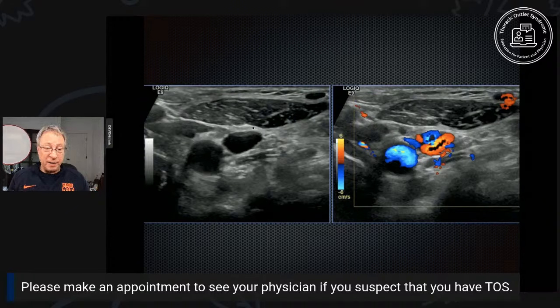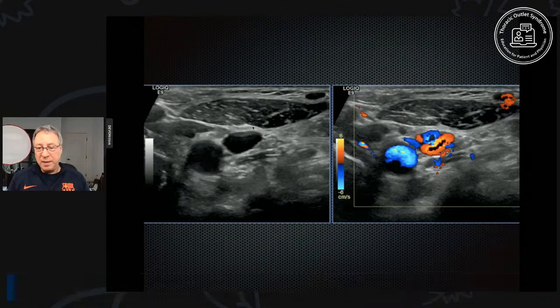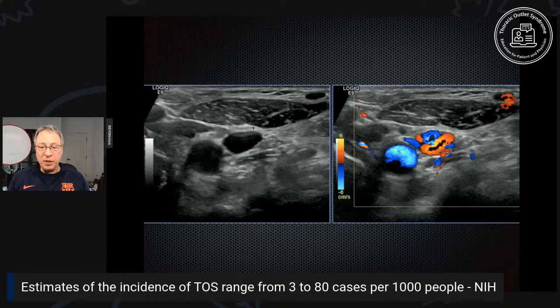Now, what ultrasound is good at is real-time imaging. You could actually have a patient move while you're watching. X-rays can't do that. These two pictures are at the same level. On the left side, you'll see there are two black holes. Those are blood vessels. One is an artery, one is a vein. And the picture on the right shows ultrasound measuring blood flow. You can see one of them is predominantly blue, that's the vein here. One of them is predominantly red. My mistake, actually, the blue one happens to be the carotid artery. And the one that's mostly red is the internal jugular vein. But the point is, you can see blood flow, not only as color, but you can measure the velocity and the turbulence of the blood flow.